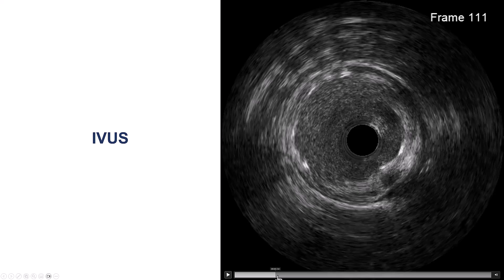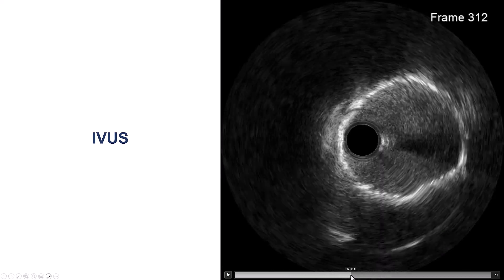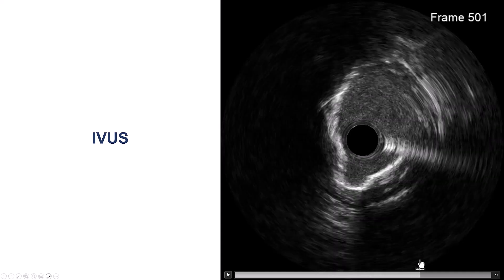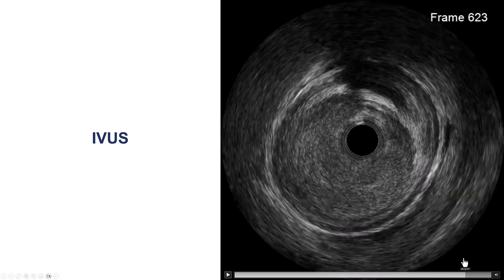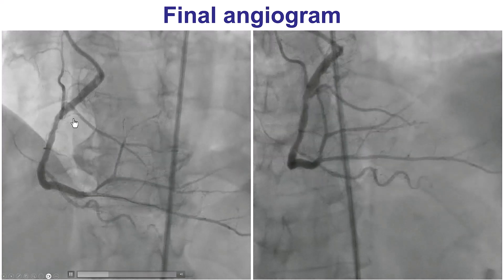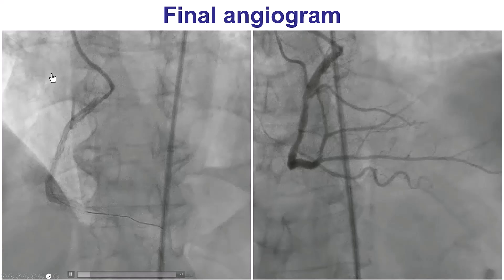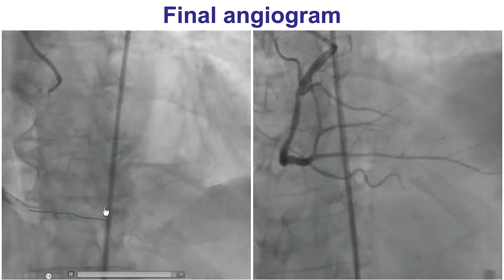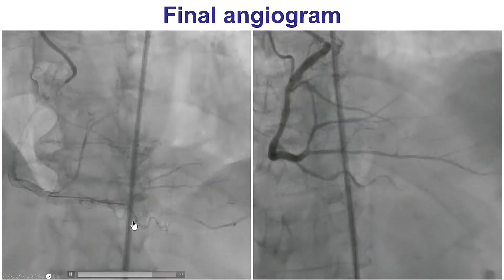We performed intravascular ultrasound, which showed the stents were well expanded with a good minimum lumen area. Because we placed a drug-eluting stent outside the covered stent, that may help potentially reduce the risk of restenosis with the covered stent. This was the final angiogram on the right coronary artery. We were initially planning to also do the left system during the same procedure, but given the challenges and complications, this was staged for a later date.